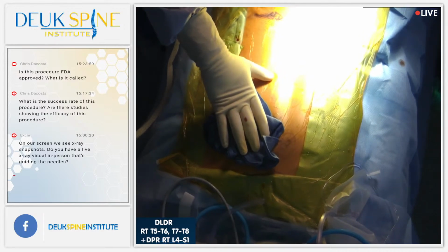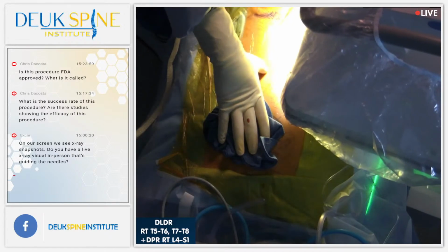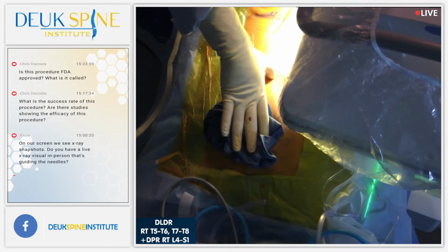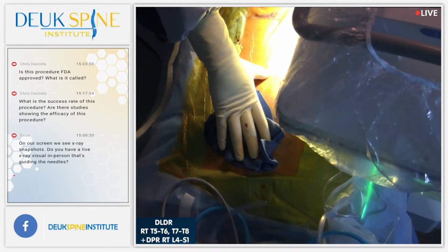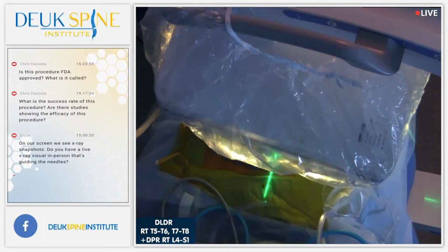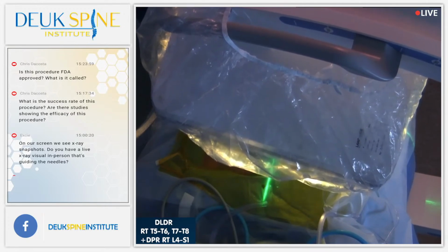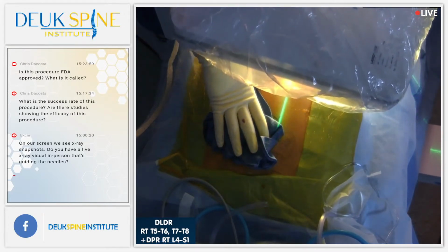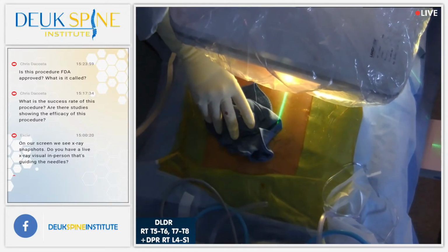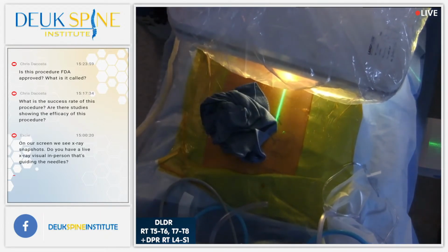To deaden a peripheral nerve, you have to cut through what's called the epineurium and perineurium. You have to literally cut through it so that nerve can't grow back. And the problem with RFA, radiofrequency ablation treatments for facet pain, is that the nerves always grow back because the RFA doesn't actually cut through the perineurium and epineurium of the nerve. It just phases the nerve, and the nerve just comes back to life and grows back. So with the plasma rhizotomy we do, we're able to kill the pain from that nerve because we were able to effectively destroy that peripheral pain nerve. And that's what we're about to do.